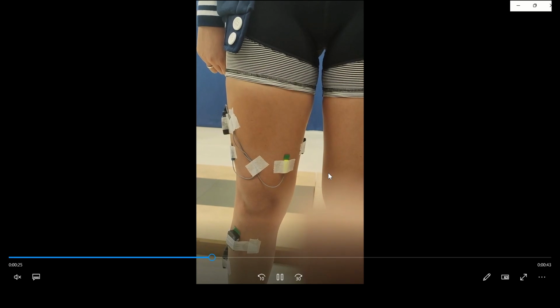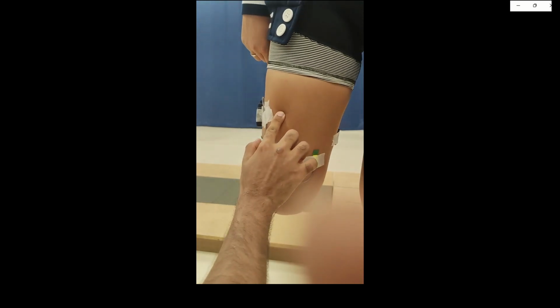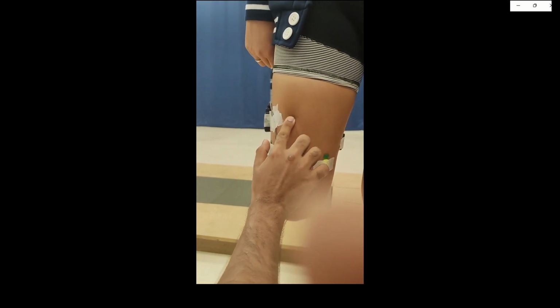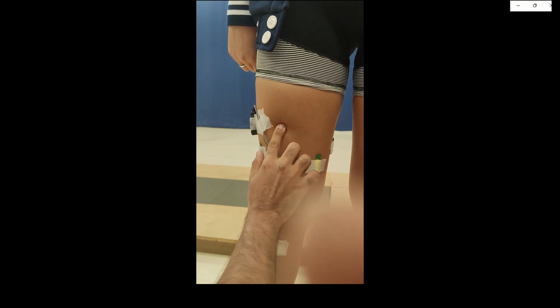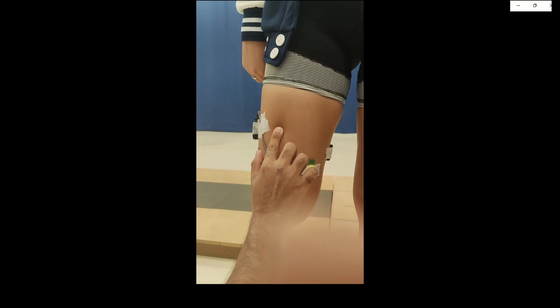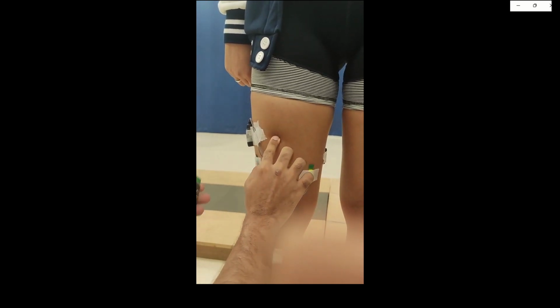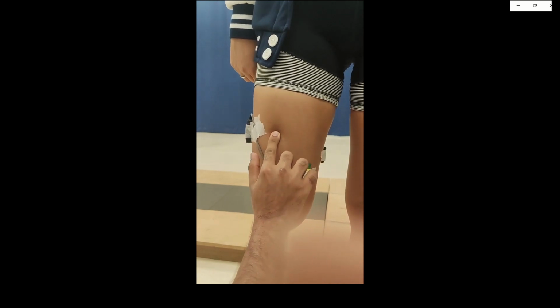Once the area is cleaned, you need to find the most prominent bulge of the muscle. To do that, I'm asking the subject to tense their leg and then to flex it up and down. What I do is I just feel with my finger, that's palpation, until I can find the most prominent bulge of the muscle. And once I've found it, I place the sensor at that point.